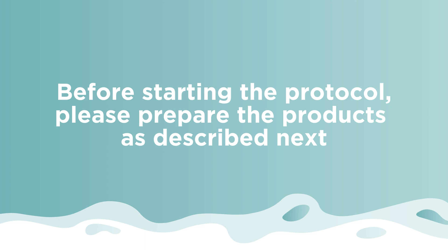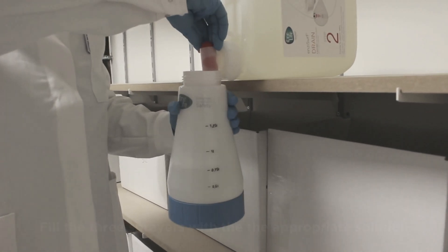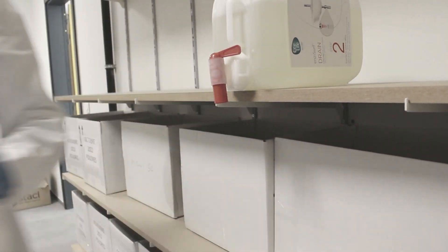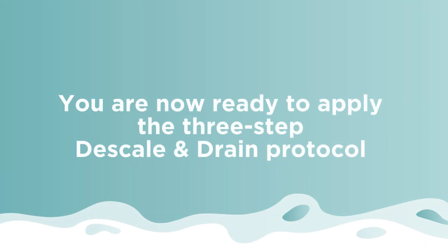Prepare the products as described, then fill the three sprayers with the appropriate solutions. Make sure you do not exceed 1.25 liters of liquid in each sprayer. Pump to put the sprayers under pressure. You are now ready to apply the three-step descale and drain protocol.